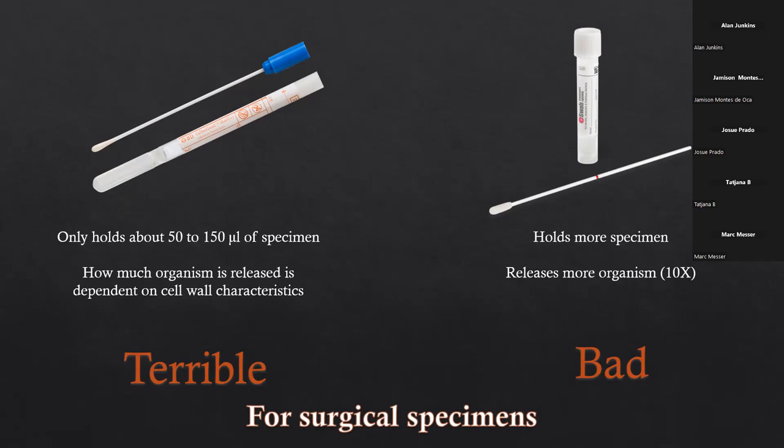These are a couple of swabs that are commercially available. The BD culture swabs — traditional rayon swabs — that rayon tip is wrapped pretty tight, it's hard for specimen to really get in there, and they don't hold much. Numbers range from 50 to 150 microliters of specimen that actually attaches. The other problem is that hydrophobic organisms, particularly acid-fast bacilli, attach to those rayon fibers and don't like to be released. These swabs are absolutely a no-go for fungal or AFB infections. On the right side, the flock swabs are newer, hold more specimen, and release more organism — still bad for surgical specimens, but a little bit better.